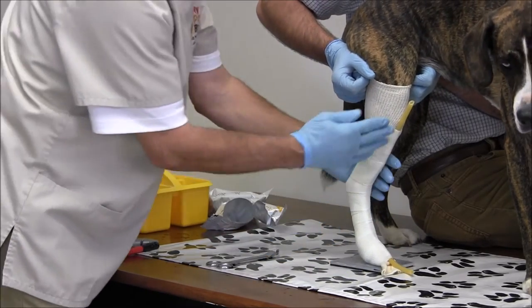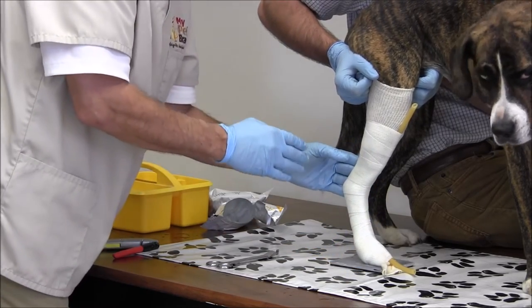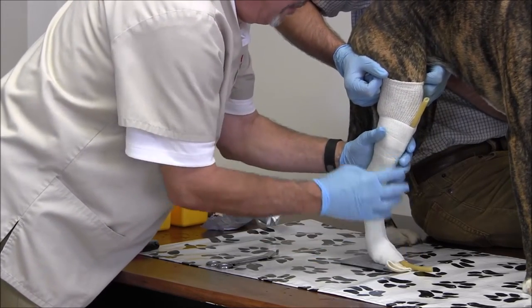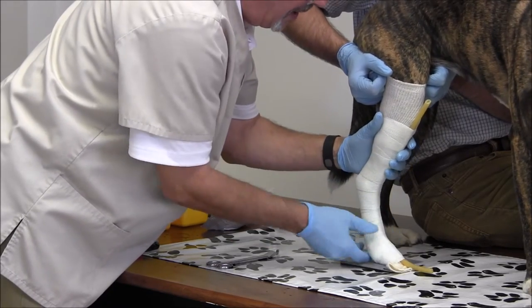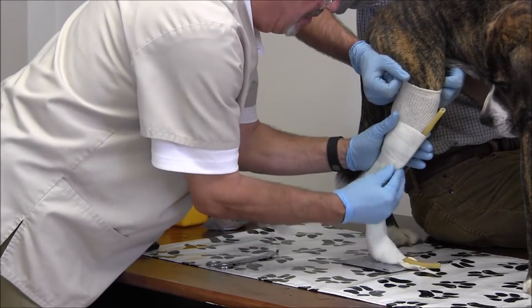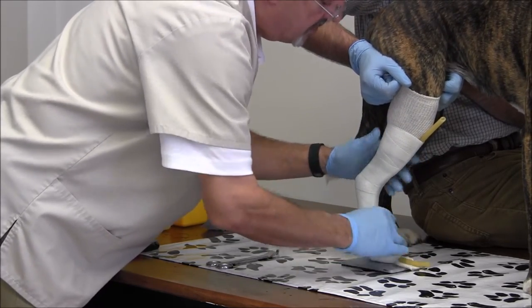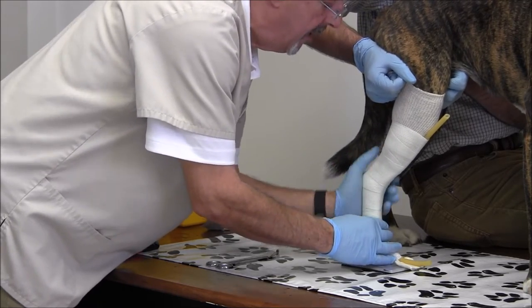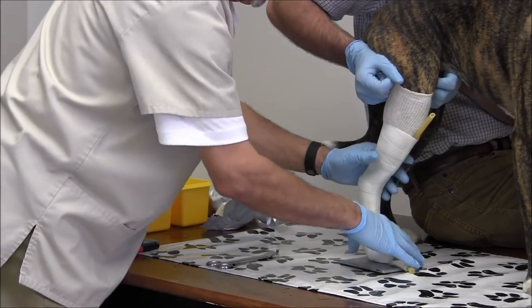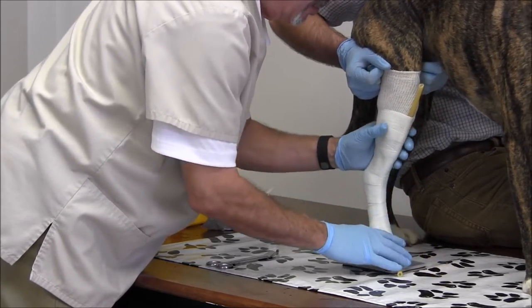It's really important that we have the angle of the cast in the angle that we want the brace made in — so we want the paw at 90 degrees and we want to match the angle we want the brace to be in. We don't want it hyperextended or hyperflexed; natural carrying angle is what we're looking for. We're going to massage this in, making sure we massage it around the Achilles tendon and around the calcaneus. Then make sure the paw is pointed in the right direction and is not in varus or valgus, or internally or externally rotated.